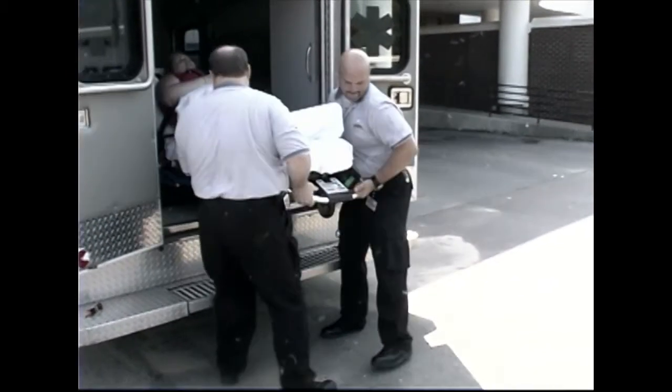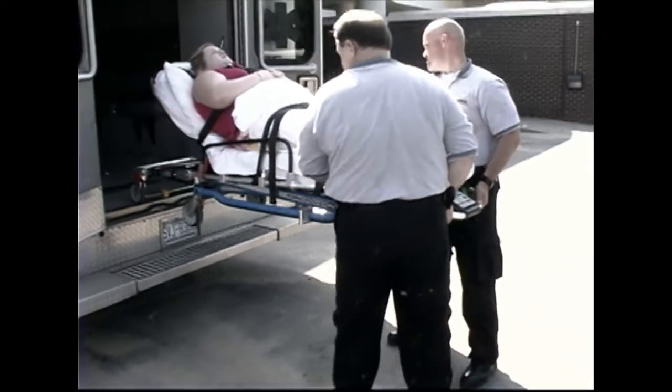Before placing the cot in service, be certain all personnel who will work with the cot are trained.